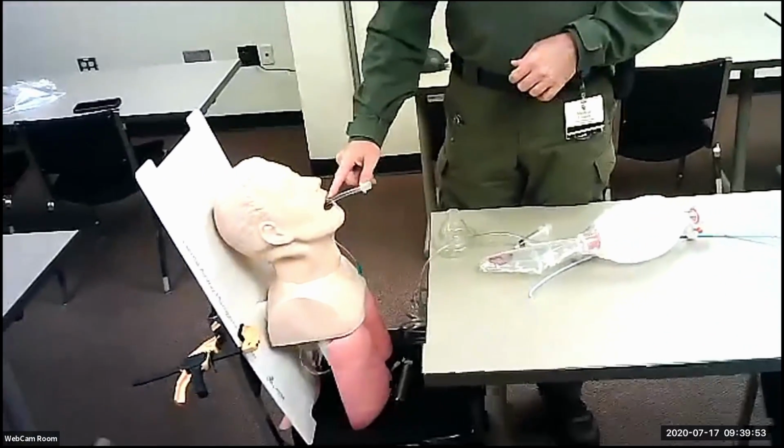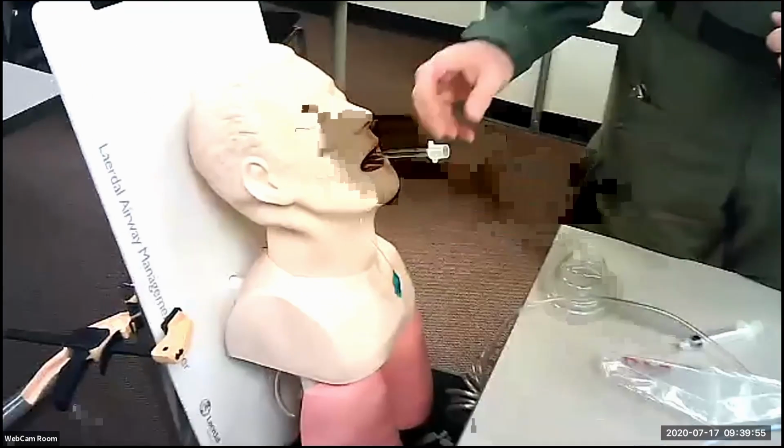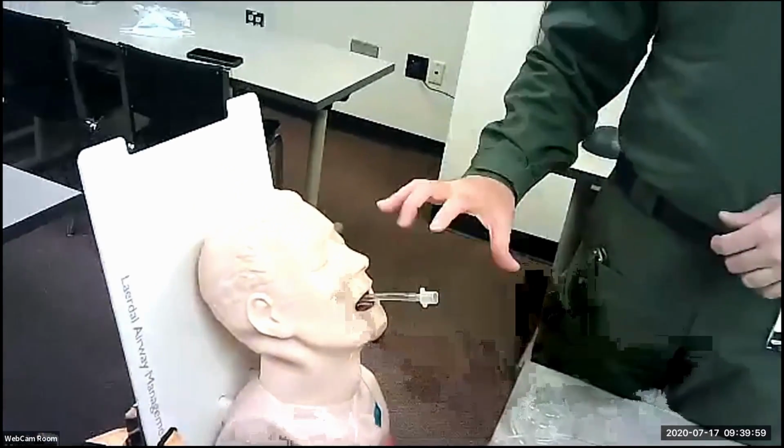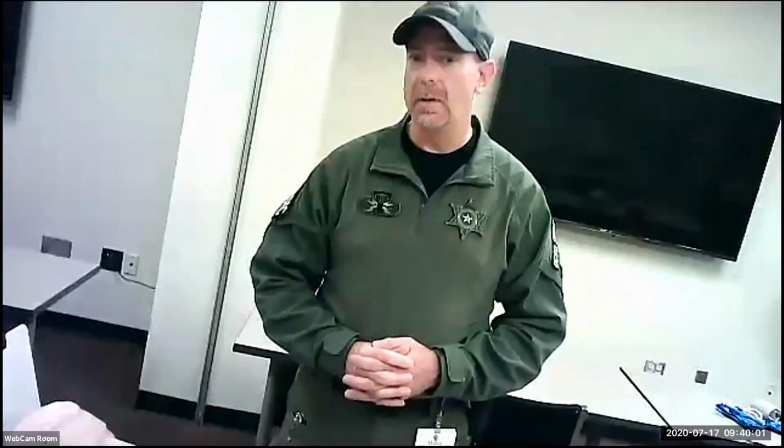The other thing is condensation in this tube. Every time they exhale, there'll be some condensation. So it'll be there, and when we bag them again, it goes away. And the last thing for you PA students is get a chest X-ray. That's what's going to hold you up in a court of law. So get a portable chest X-ray for confirmation. That way you can look at it and go, yep, there it is right there.